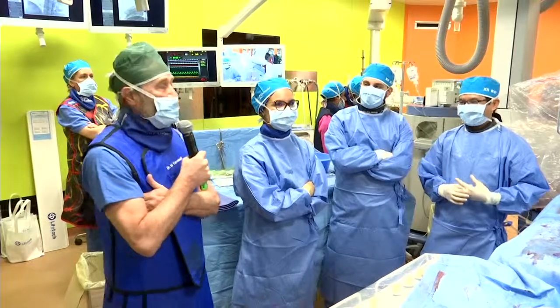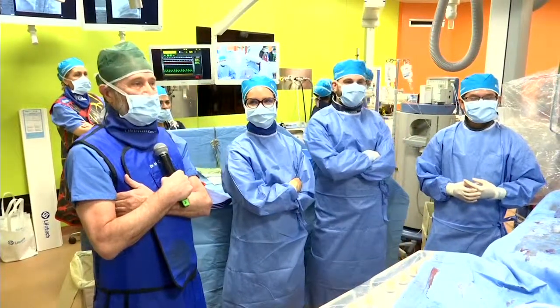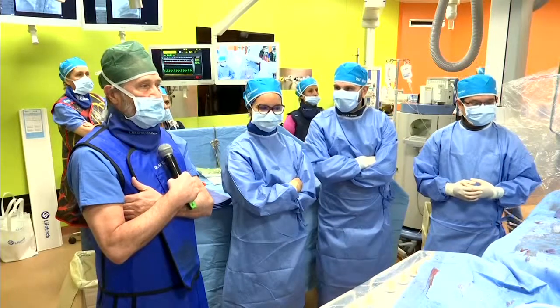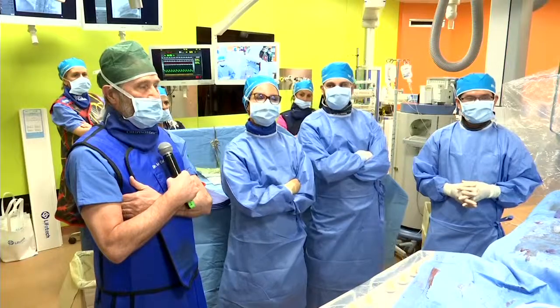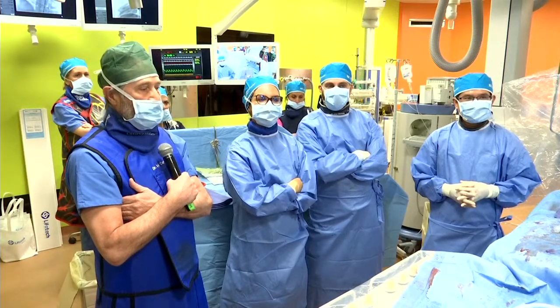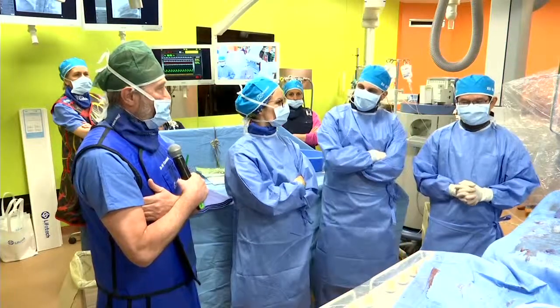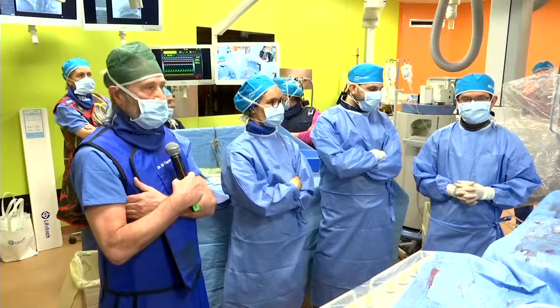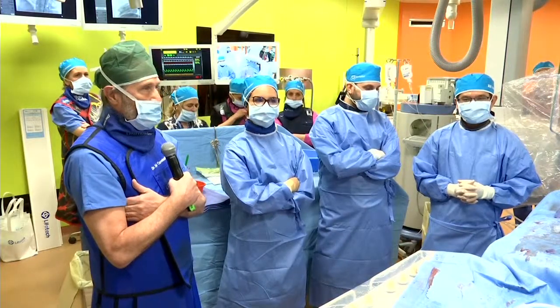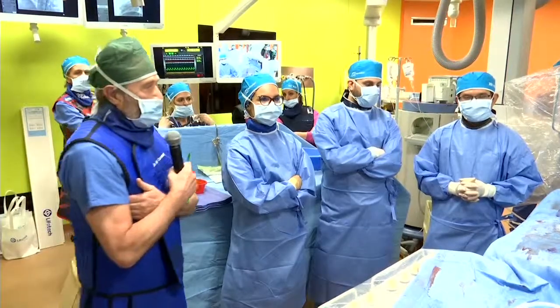Thank you. Let me ask the audience a question. How many of you have experienced complete heart block with an ADO1 device? Is it only one person who has seen it so far? Anybody else in the audience who has seen a complete heart block with ADO1 or ADO1-like devices? Okay. Yeah, go ahead, please.